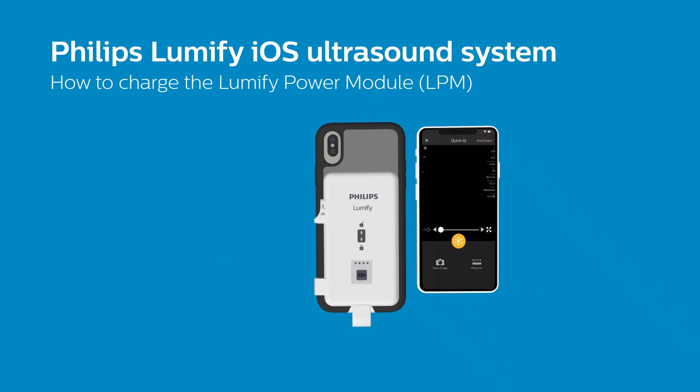If your LPM is connected to your iOS device via the rigid connector or flexible cable, you may be able to charge both devices in parallel.